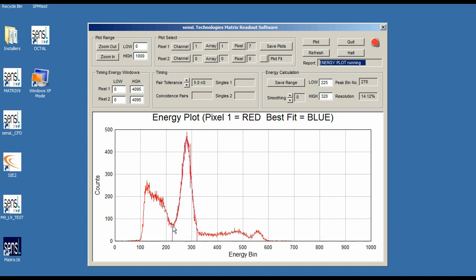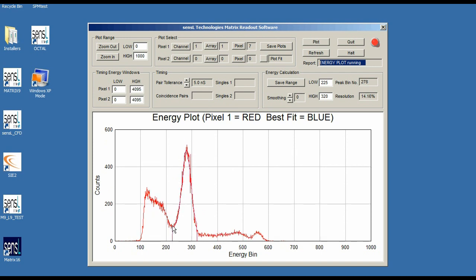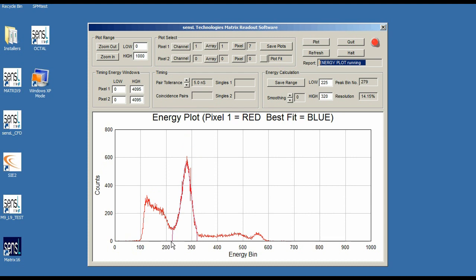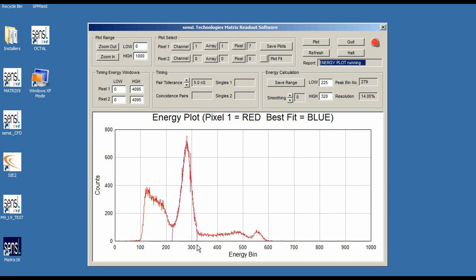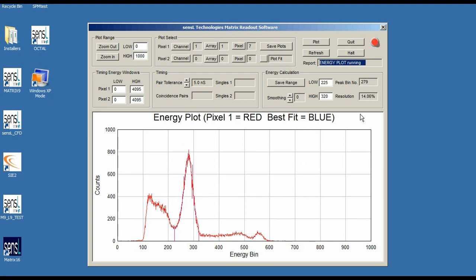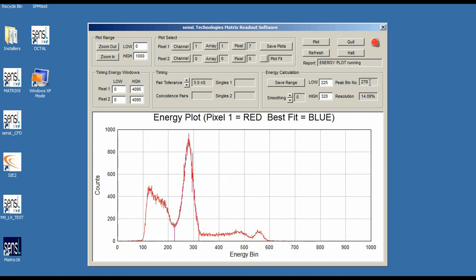You can see here how it's showing the bars for the edge of the curve fit are going down to the x-axis at 225 and at 320. You can see that happening. What's really nice is you can see the peak bin number here. Currently it's saying 278 or 279 depending on what's the highest one.